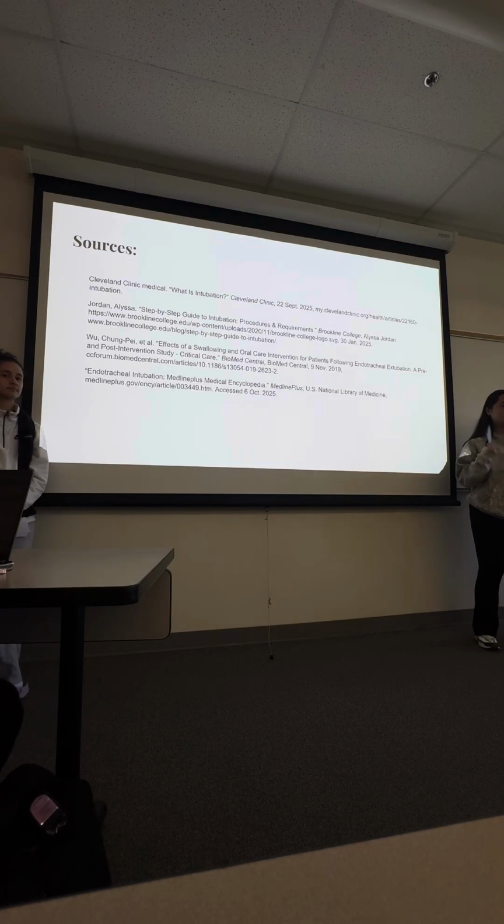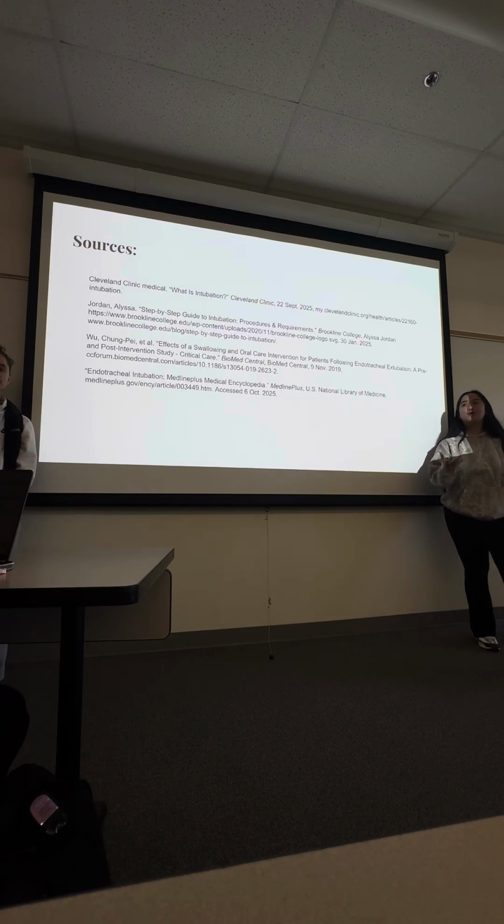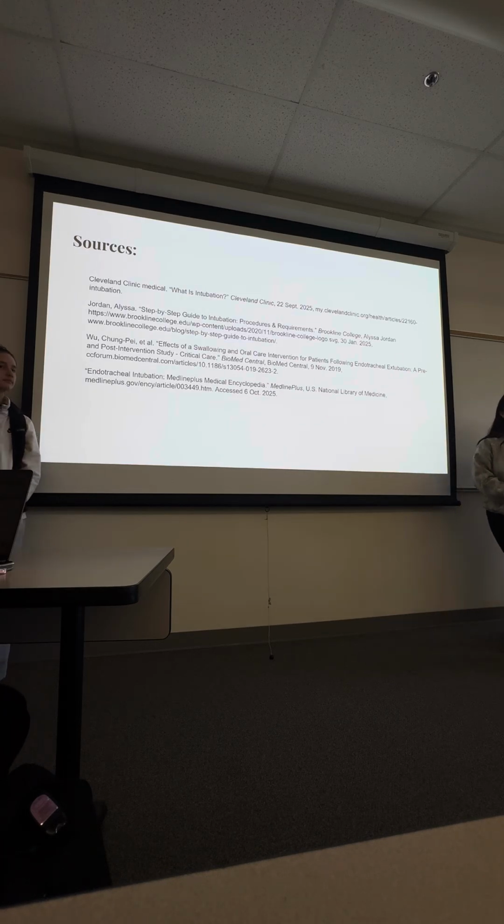What's a BiPAP? Do you know what a CPAP is? It's the breathing machine when you have sleep apnea, yes. But a BiPAP has two forces of air. So when you're inhaling, it's stronger, and when you're exhaling, it's lower. A CPAP is constant air, I believe. Okay. Any other questions?